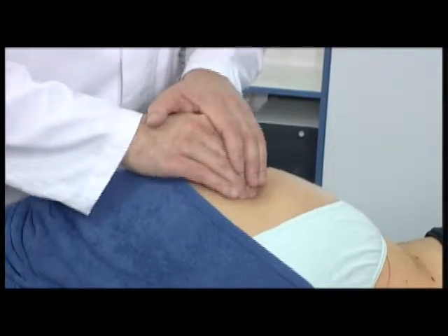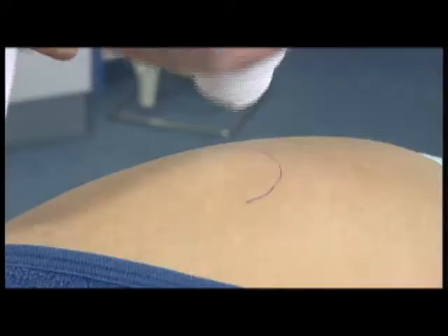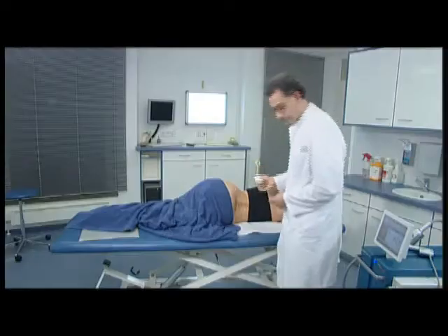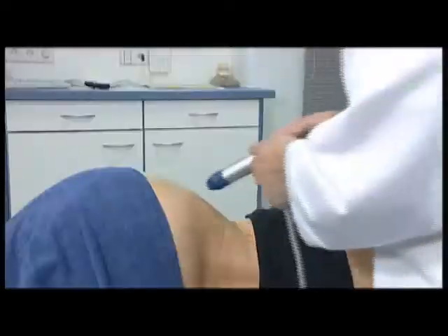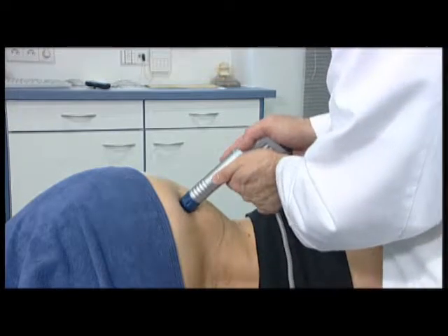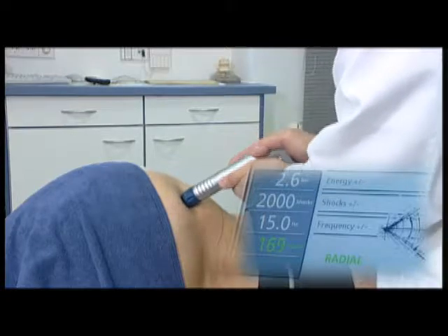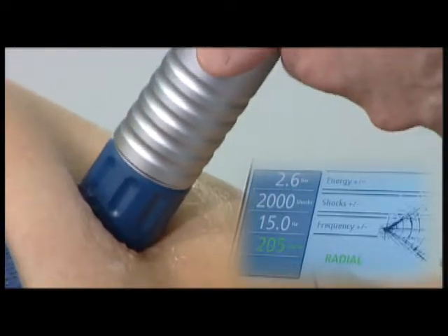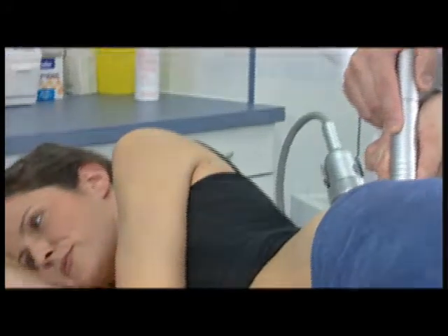Before treatment is started with the Duolith SD1, the painful spots are localized by palpation following the patient's indication of pain. Afterwards, coupling gel is applied to the skin. Treatment is started at the point of maximum pain using the patented radial D-actor technology. The deeper the site of the pain region, the higher the application energy can be selected, and the more firmly the D-actor can be pressed on the application area.